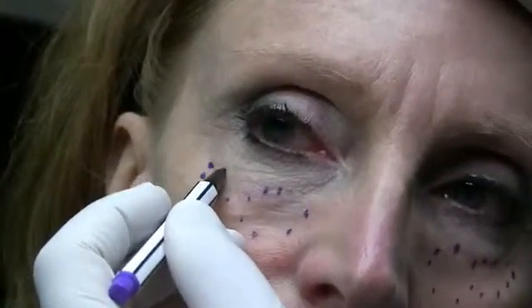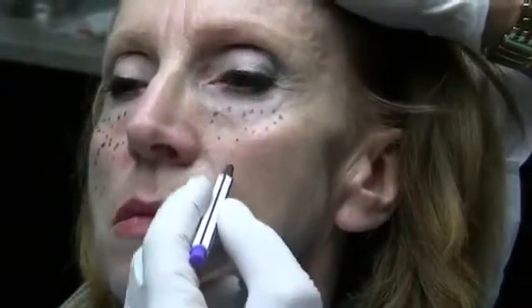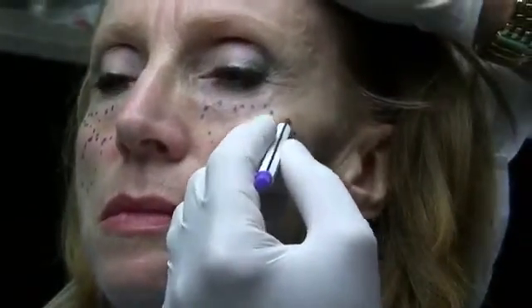Again, the big challenge with filler is generally the volume that you can use, and the limitation is usually expense. So these are the areas that we're going to treat, and then my secondary or tertiary area, depending on how much filler we use, would probably go down into this region.